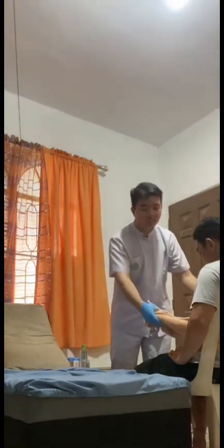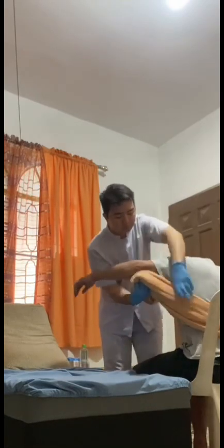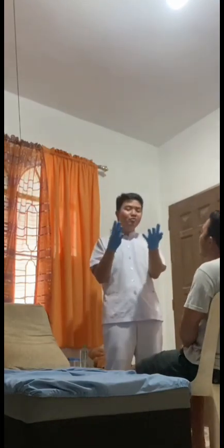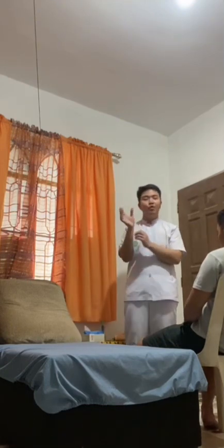Now that the patient is already sitting, I will remove the towel around the waist of my patient. And next, I am going to remove my gloves, perform hand hygiene and document the data. And now I'm going to transfer the patient from chair to bed. Same procedure, I'm going to perform hand hygiene.